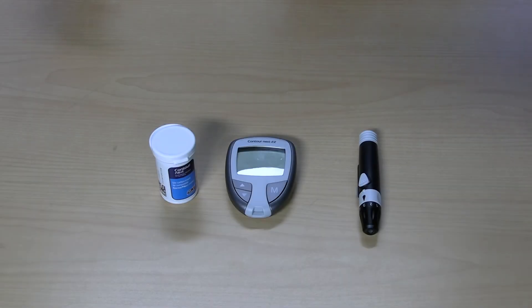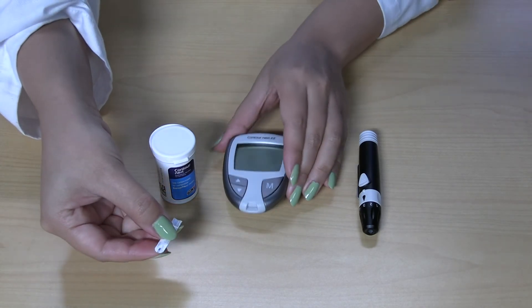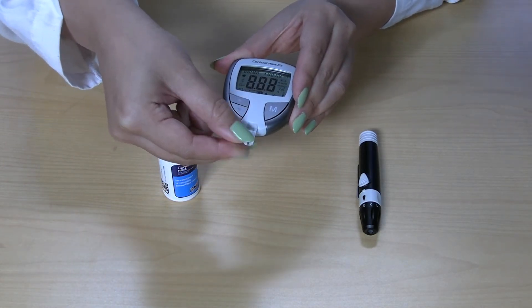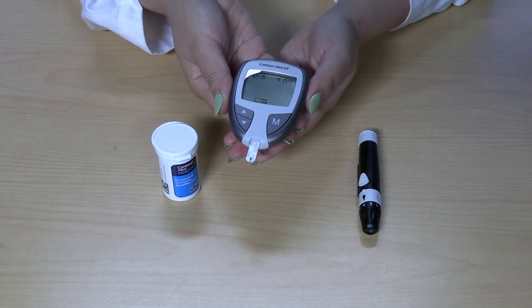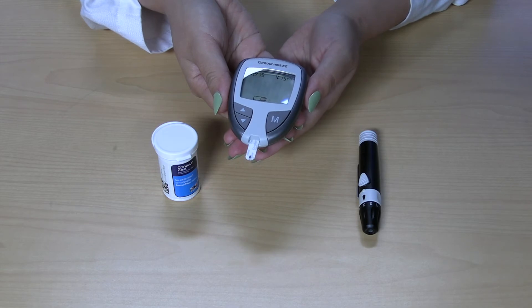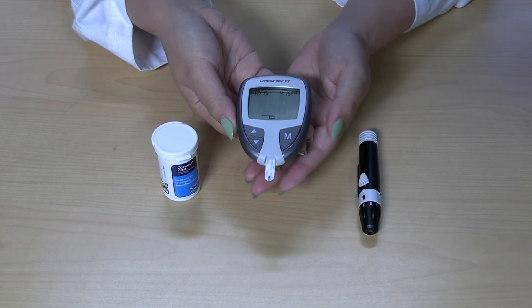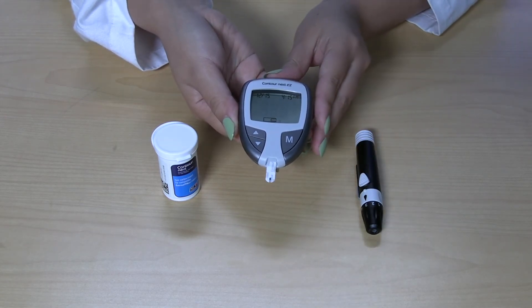Next, get your test strips. Stick the gray part all the way into the monitor, which will turn the monitor on. Depending on your monitor brand, you may need to press an on-off button. The other part of the strip is where the blood sample will be collected. Now you are ready to poke your finger.